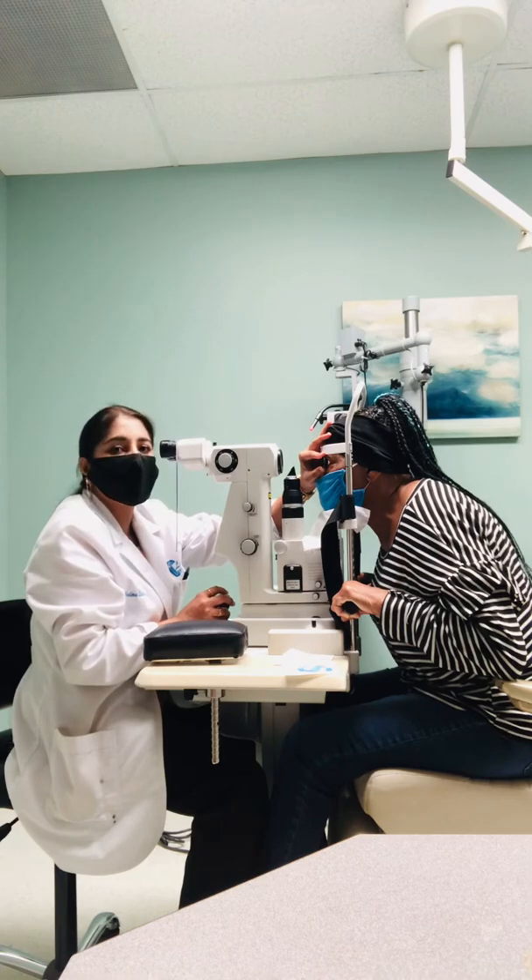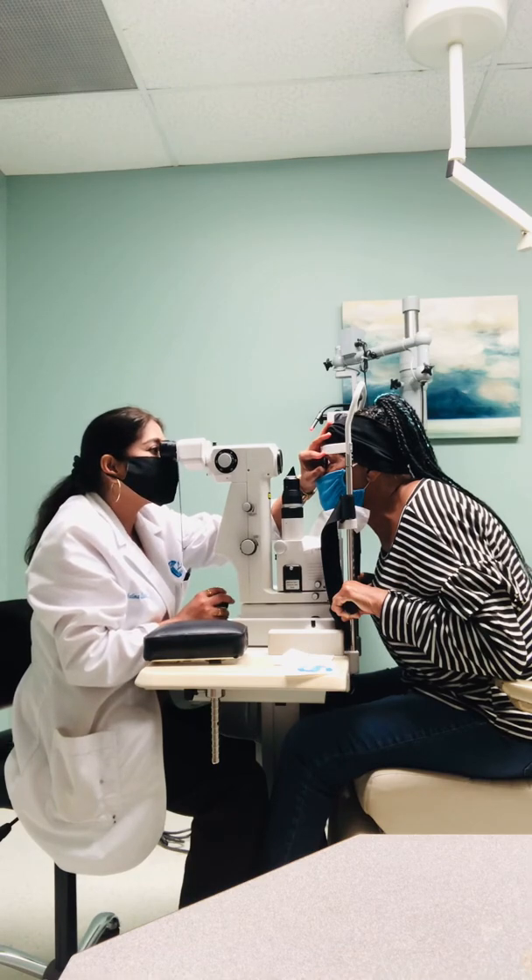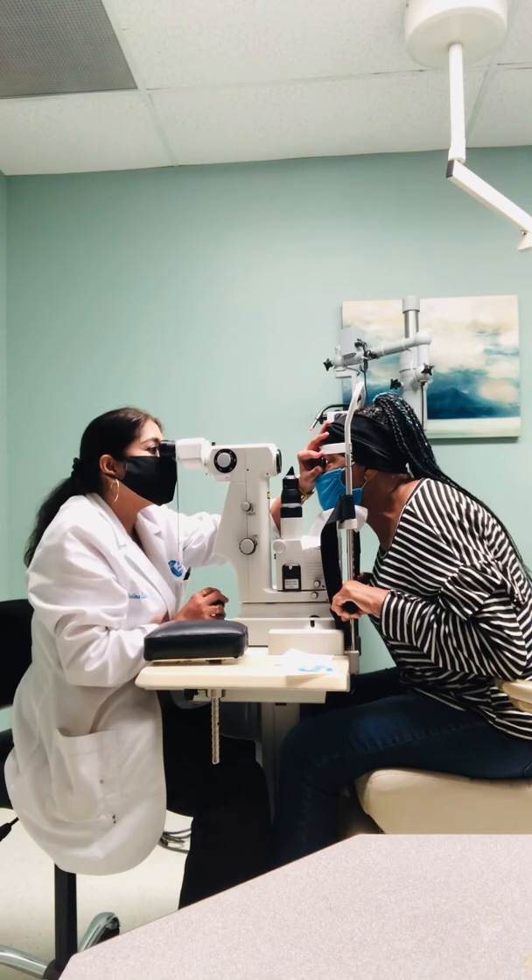I'm going to go in and make it a little bit bigger so that it never closes. We do a couple of shots in there. My settings on the machine are already set, so I know exactly how much power and how much energy is going in.